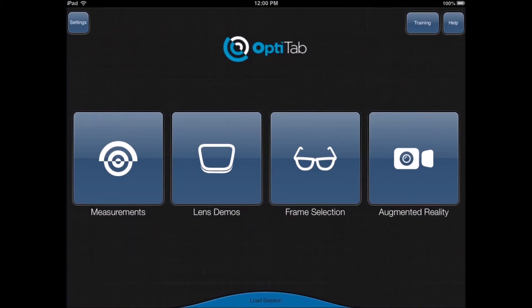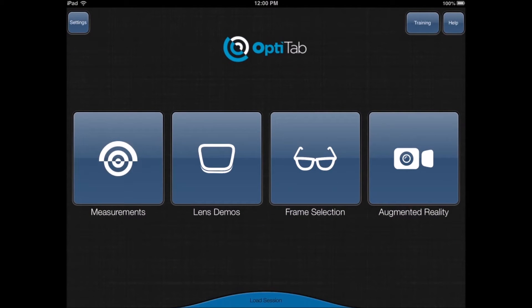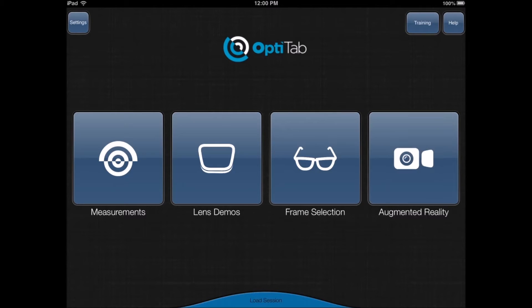When you launch the app, you are presented with measurements, lens demos, frame selection, and finally augmented reality.